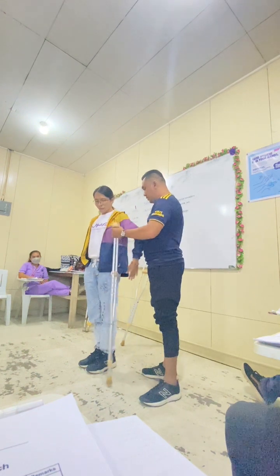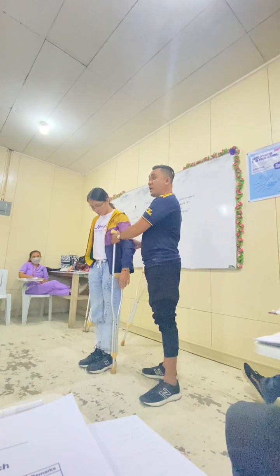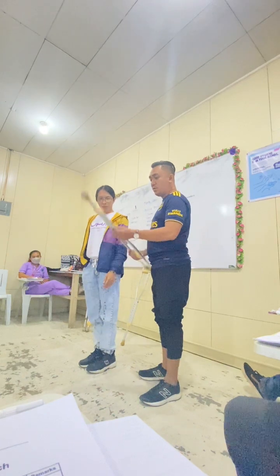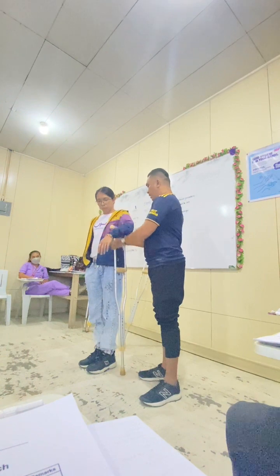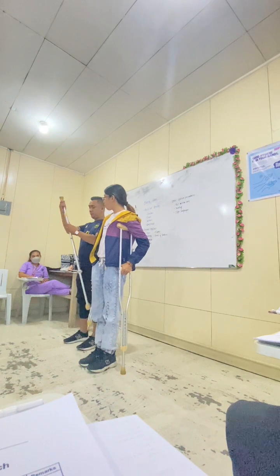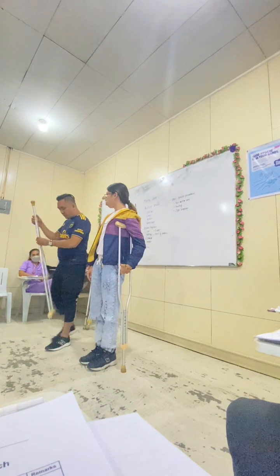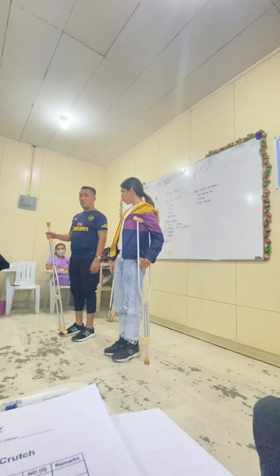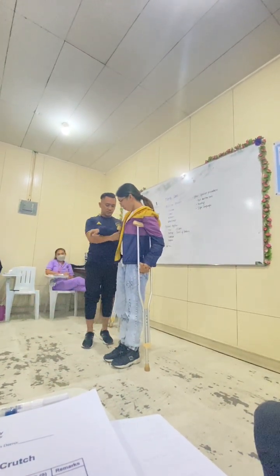Because taas ang shoes, so let's go with 5'6". Okay. By the way, when you make an adjustment, please do not put the crutch pad on the floor. Nakikibutang sa armpit ni patient, so the armpit of the patient gets dirty. Okay? So we put that on the sides.